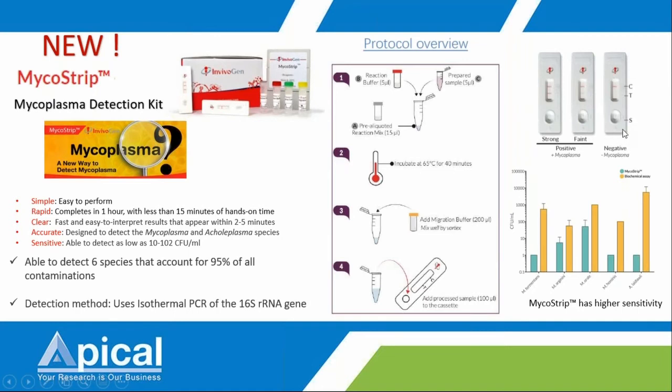But now you can use such a kit to just detect the mycoplasma in your cell culture. The detection method uses isothermal PCR of the 16S rRNA gene. Basically, all you have to do is mix. This is the sample preparation: you have your prepared sample, which means your cell culture supernatant.